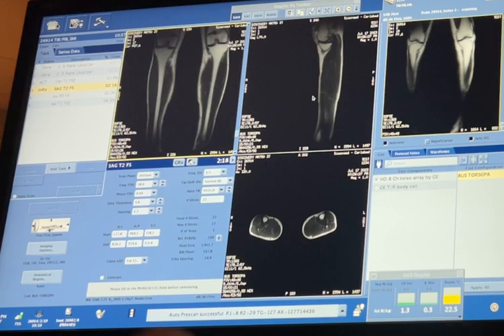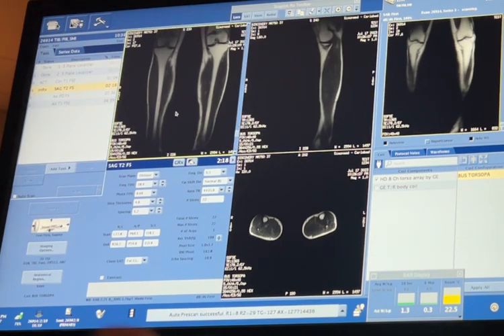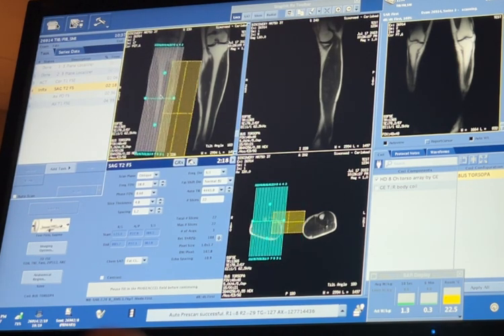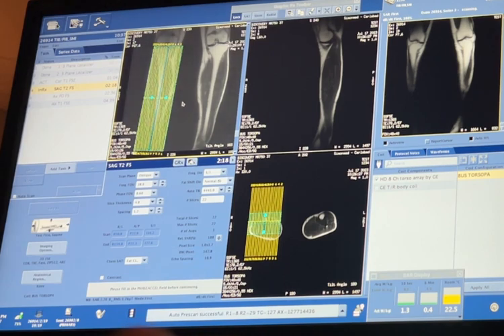I want you to pick a leg. We're not going to be able to see either one very well, so yeah, why don't you just pick a leg in the meantime? On the coronal. Alright. Do I get rid of this or? You can move that over it, and then we'll get rid of it. And then, so why don't you brighten that up? Up and to the left. You can angle both with the button. You see how they're both kind of very close.